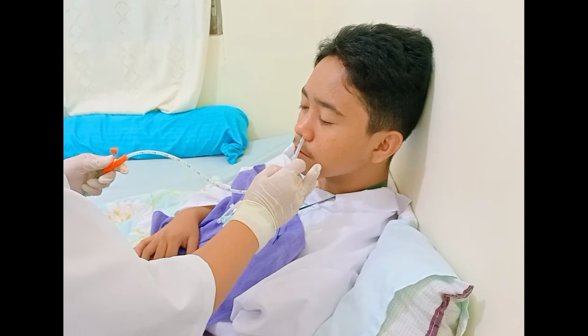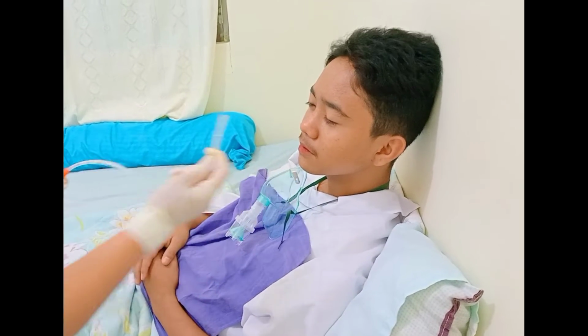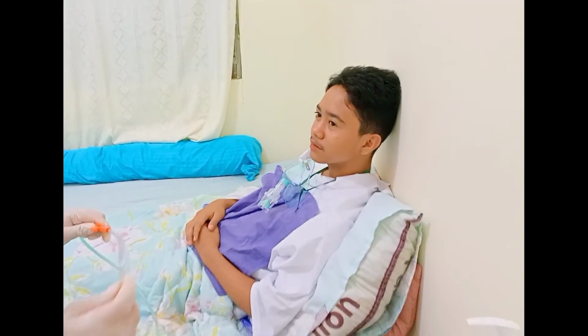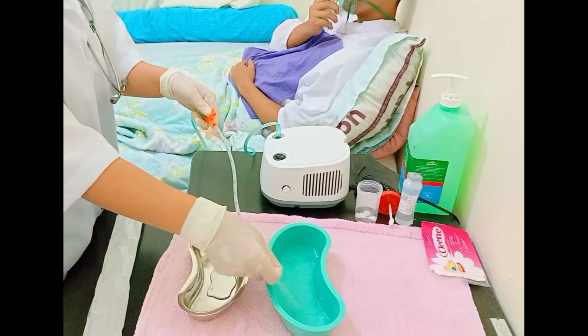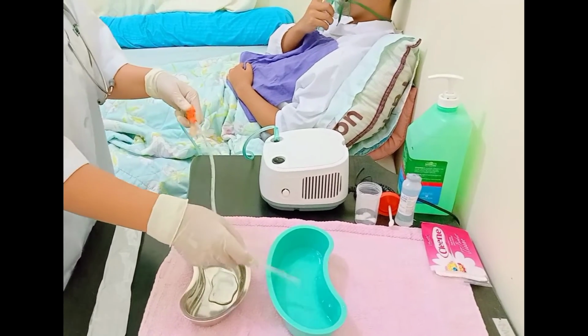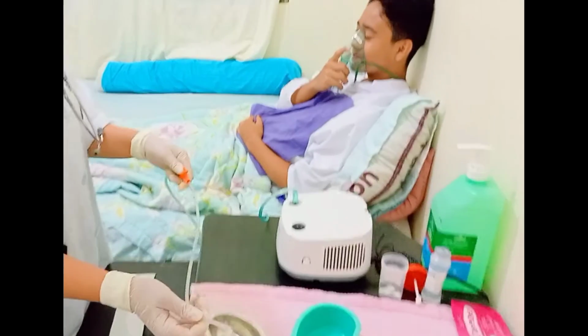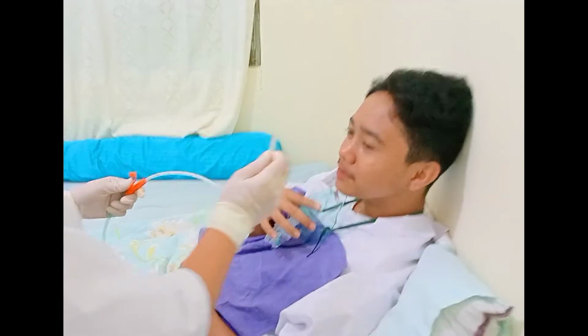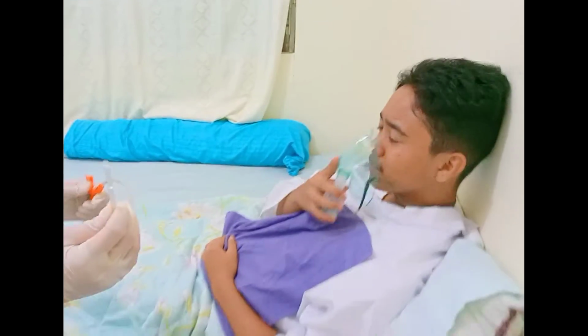For suctioning, each attempt should last only 10 to 15 seconds, during which time the catheter is inserted, suctioning is applied, and then suction is discontinued and the catheter removed. Rinse and flush the catheter and tubing with sterile water or saline. Encourage the client to breathe deeply and cough between suctions.